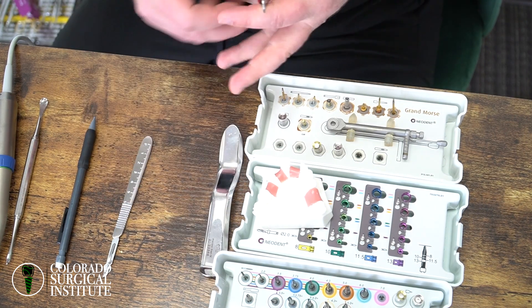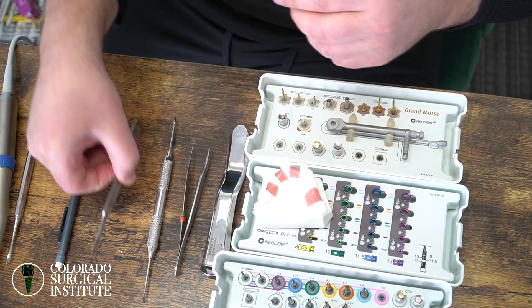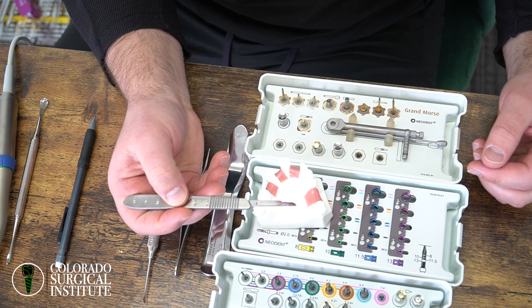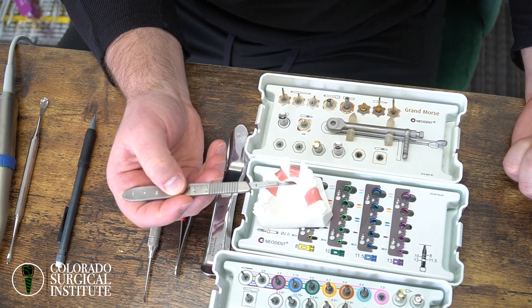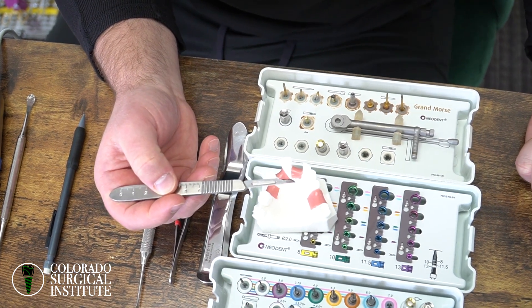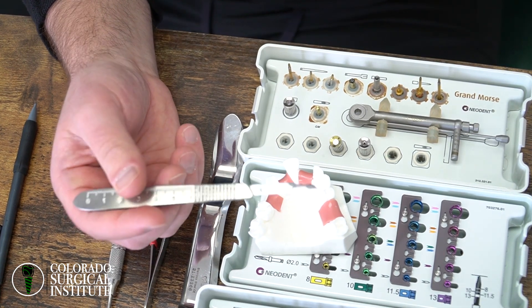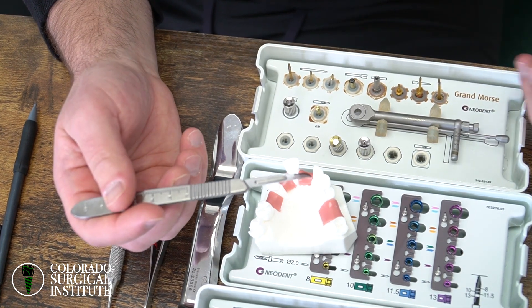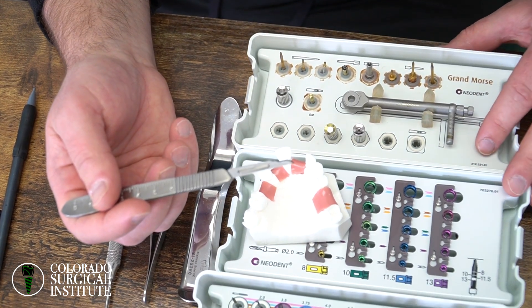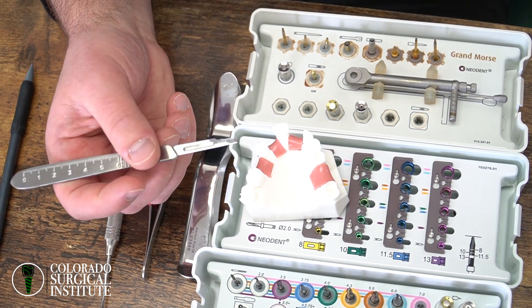As far as your blade goes, I always use a 15c — this is a slightly smaller one. You can use a 15 or 15c, it doesn't matter. Other choices include a 12 blade, which I'll sometimes use in really hard-to-reach areas.